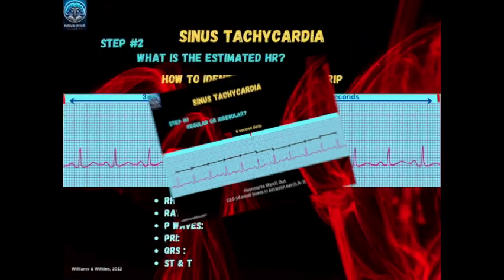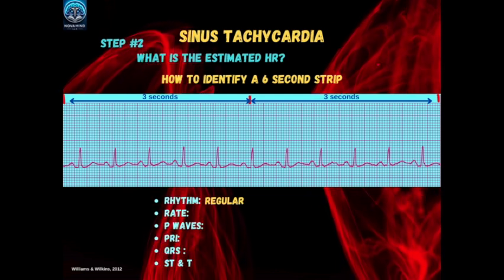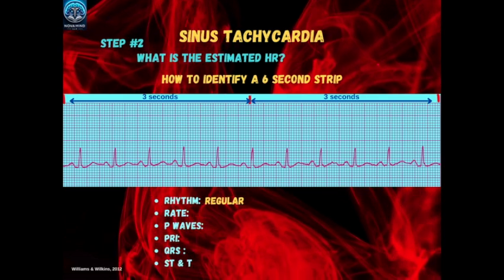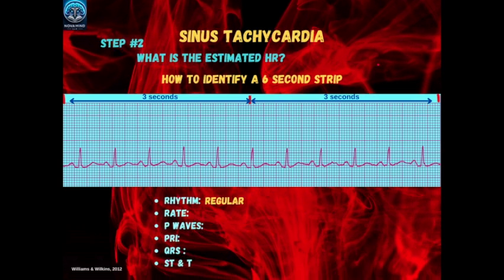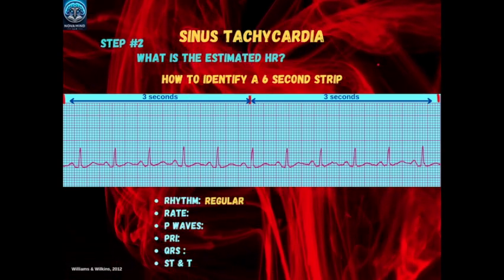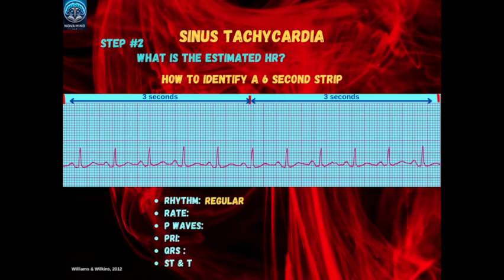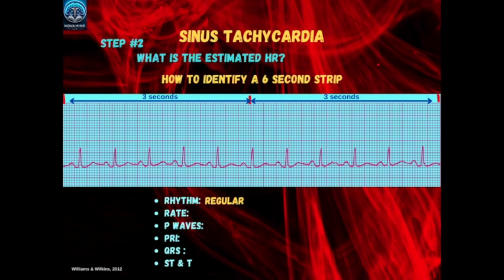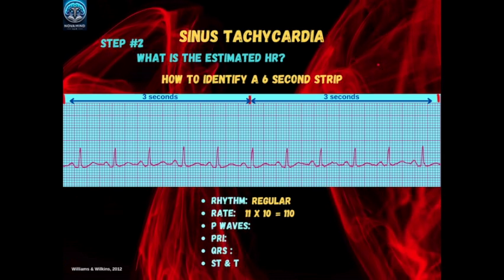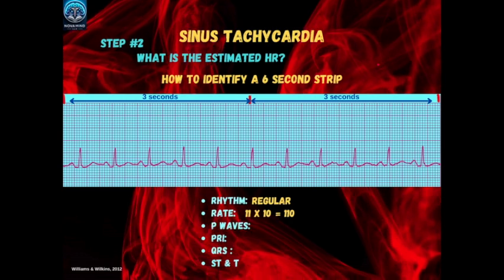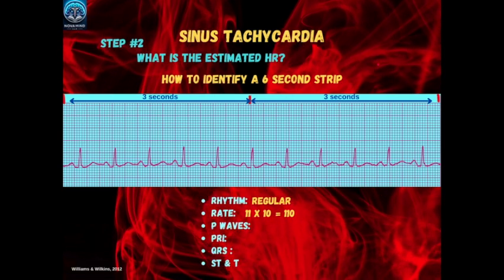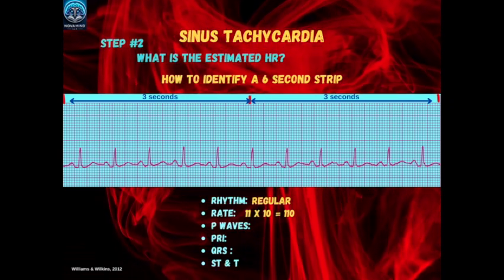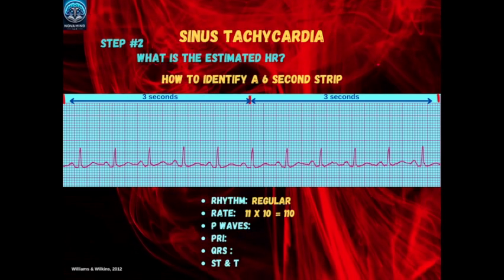Step 2 involves estimating the heart rate. First, confirm the strip covers 6 seconds by counting 30 large boxes — since each large box represents 0.20 seconds — or by looking for two sets of 3-second hash marks at the top or bottom of the strip. Once you've identified a 6-second strip, count the number of R waves and multiply by 10 to estimate beats per minute. In this example, we count 11 R waves in the 6-second window. 11 times 10 equals 110 beats per minute.